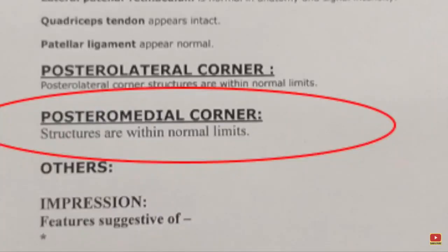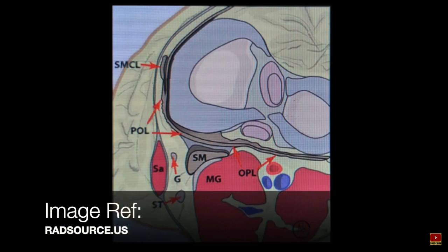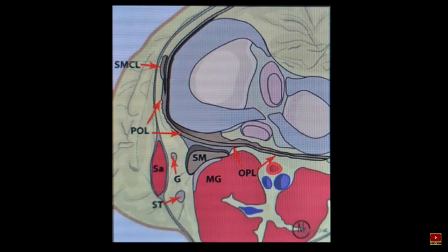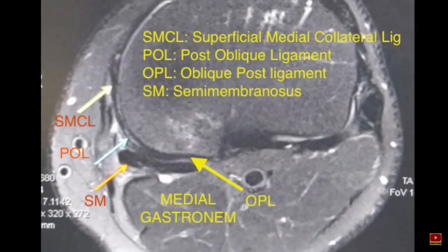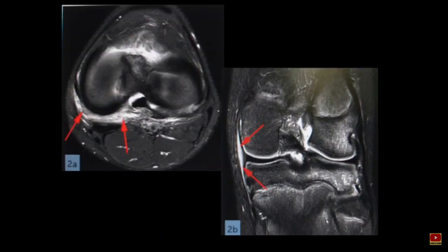Next in the format comes the posteromedial corner — a readily identifiable but very underappreciated area. If unidentified, it results in anteromedial rotational instability. The main structures we assess are the semimembranosus tendon, oblique popliteal ligament, posterior oblique ligament, posterior horn of the medial meniscus, and the medial collateral ligament. Here is an example of injury with significant edema in the posterior medial joint capsule and significant fluid separating the superficial and deep fibers of the medial collateral ligament.